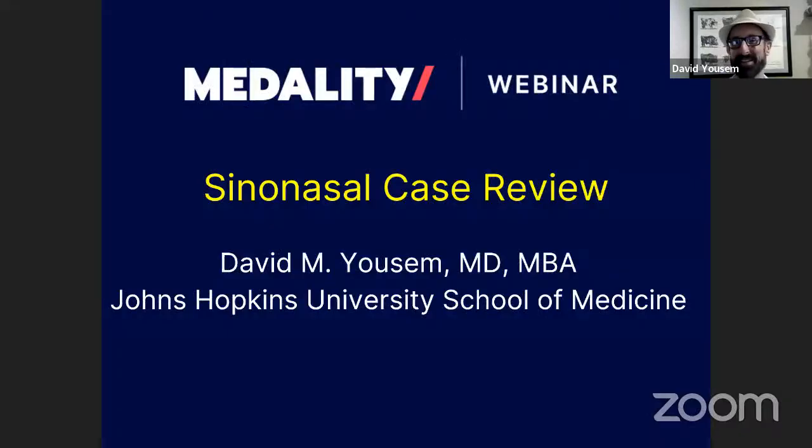Thank you very much. So today we are going to go through some multiple choice questions on sinonasal imaging unknown cases. I'd like to have as much participation as I can from the standpoint of the polling and the multiple choice answers, and we'll see how you do.